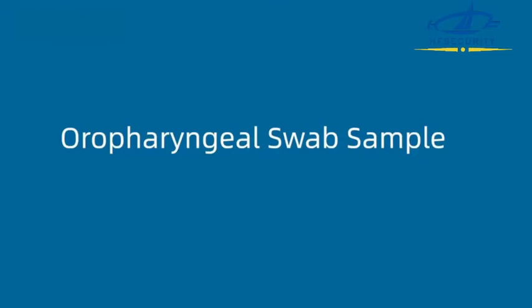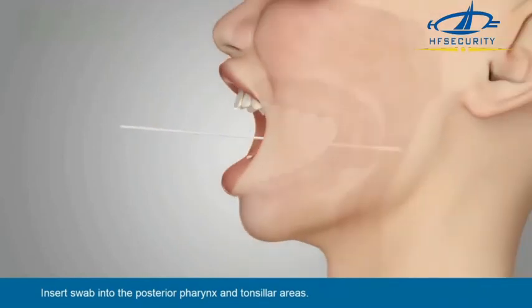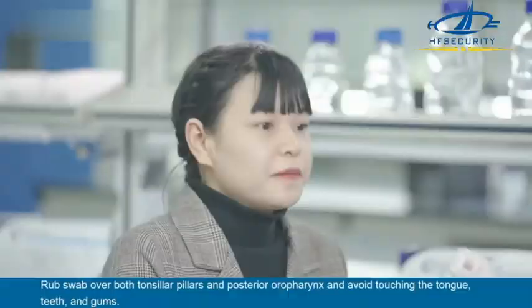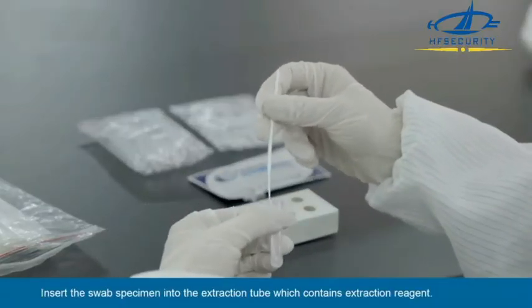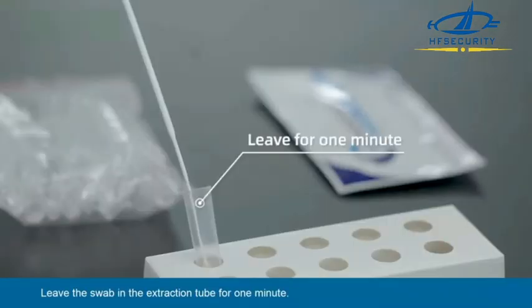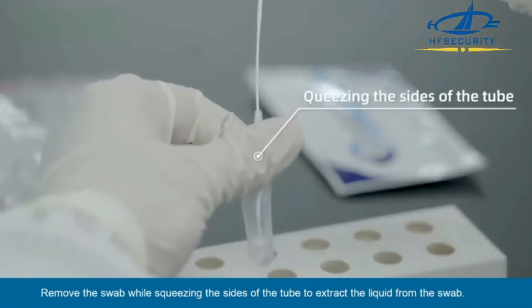Oropharyngeal Swab Sample: Insert the swab into the posterior pharynx and tonsillar areas. Rub the swab over both tonsillar pillars and posterior oropharynx, and avoid touching the tongue, teeth, and gums. Insert the swab specimen into the extraction tube which contains the extraction reagent. Roll the swab at least five times while pressing the head against the bottom and side of the extraction tube. Leave the swab in the extraction tube for one minute. Remove the swab while squeezing the sides of the tube to extract the liquid from the swab.